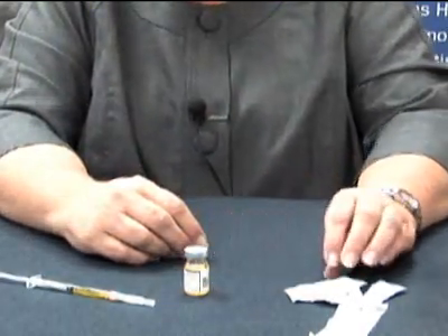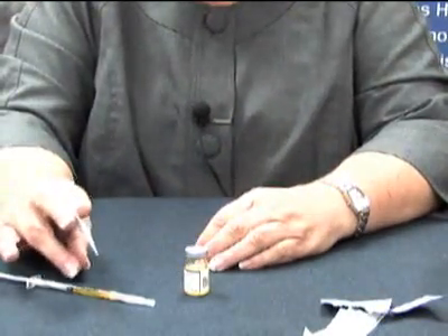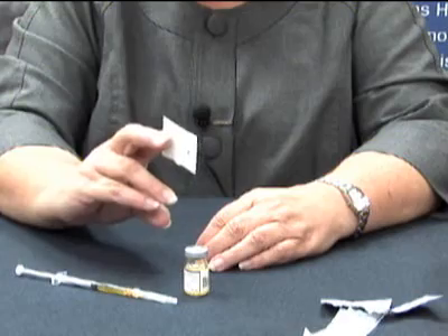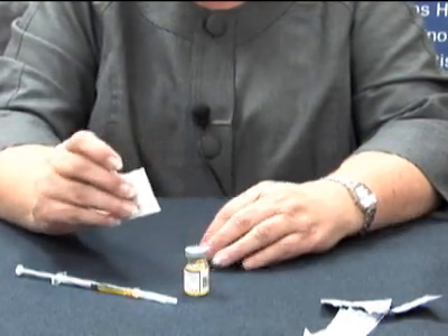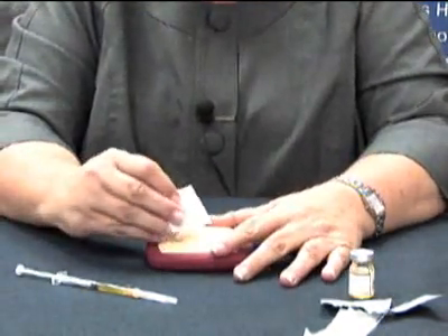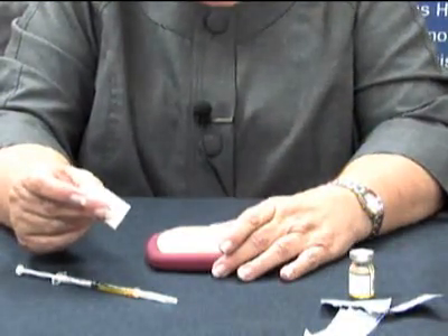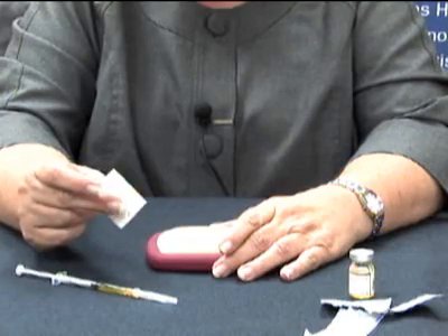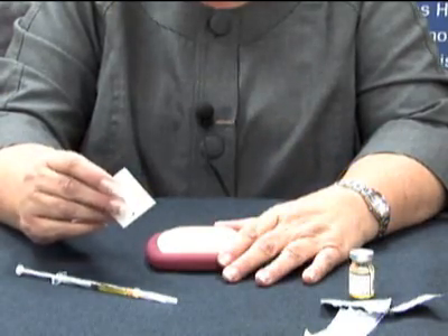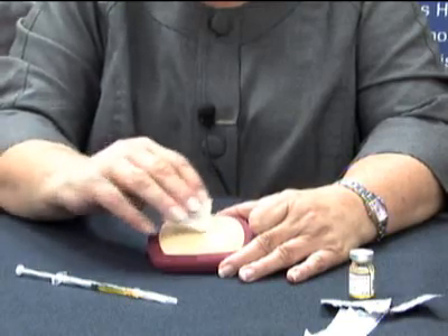The next thing I am going to do is prepare my injection site. A subcutaneous injection is an injection that goes into the layer of fat that is between the skin and the muscle. We are going to clean off our skin. The areas that you would choose are going to be your abdomen — stay at least an inch away from your belly button — or the sides of your legs along the thighs, or the backs of your arms. You want to clean that area off with your alcohol wipe or cotton ball with alcohol.